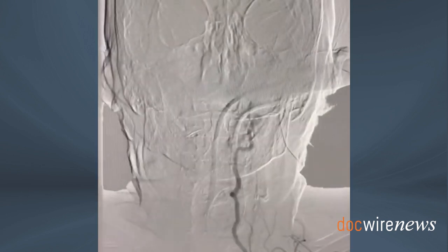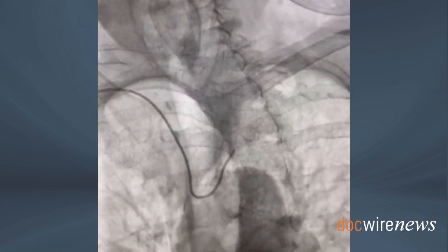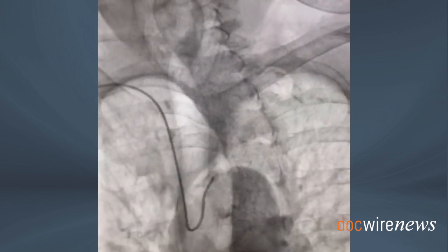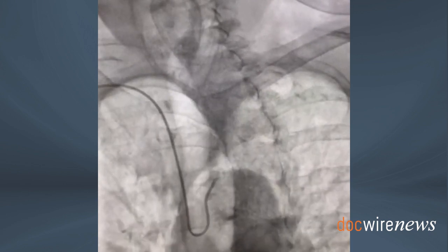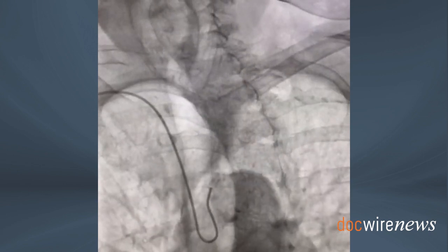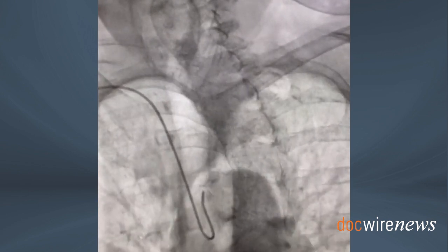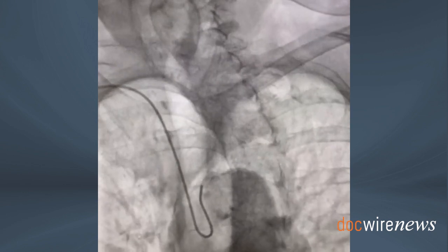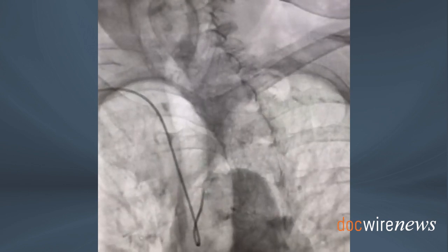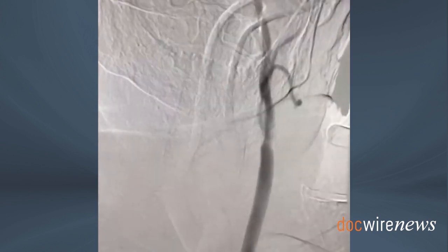It's important to take the angiogram of the entire cervical course of the vertebral artery. Then moving on from the left subclavian to the left common carotid artery in a type 2 or type 3 aortic arch. Notice that the catheter is being pushed so that it disengages in a paradoxical fashion. The catheter is now free in the aortic arch, at which point we rotate clockwise depending on the catheter position, with small puffs. The catheter engages the left carotid artery upon clockwise rotation without much push.